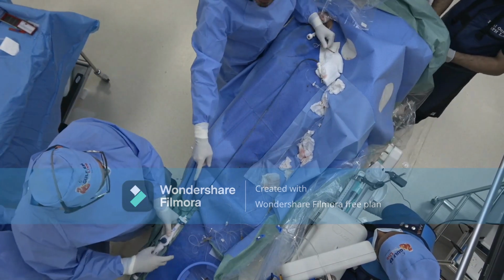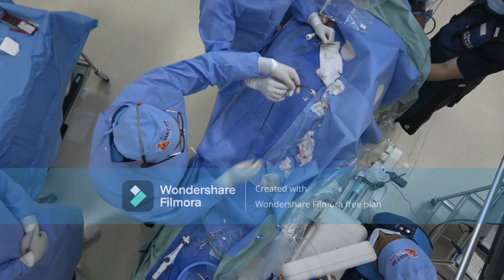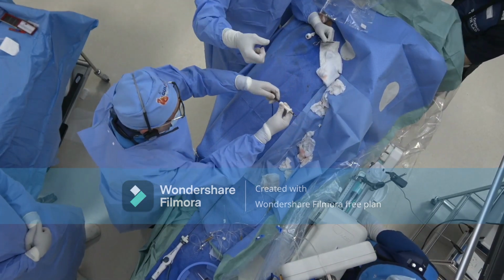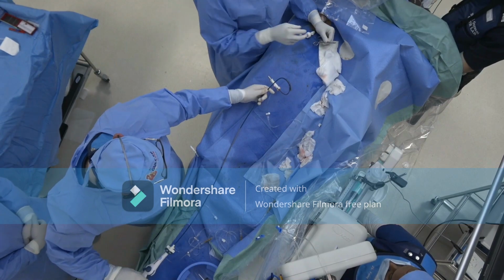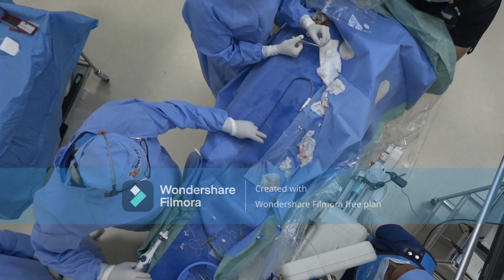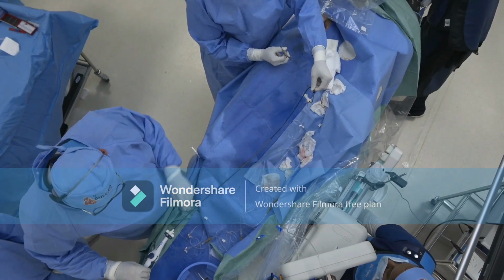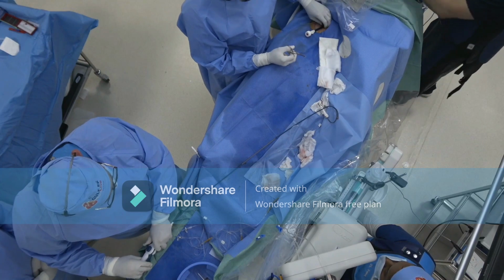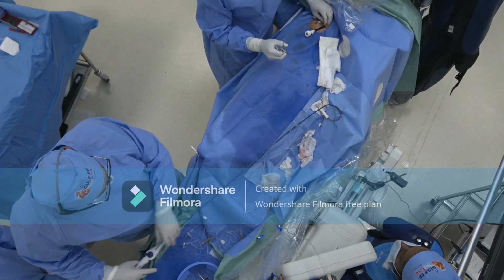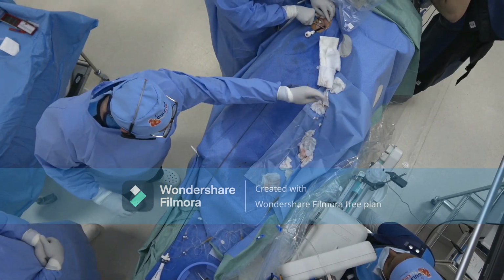So if you can see the handle in the doctor's right hand, you can actually do some manipulation, not massive manipulation. It's not like the EP catheter if you're referring to that, but you can see you can rotate up to 180, which is quite enough if you're doing such a procedure. So it will not go like a bidirectional catheter. It's only 180 in one direction, which I think is more than enough. You will not need anything more.